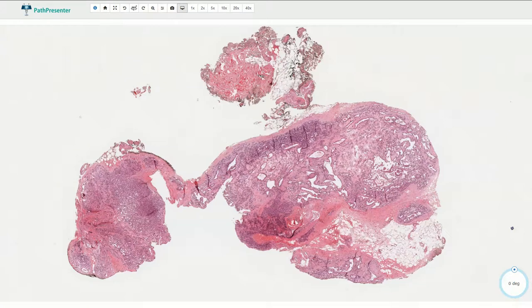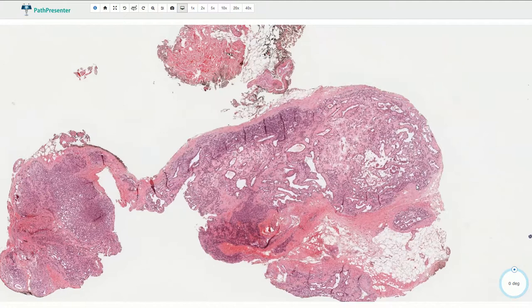Papillary endothelial hyperplasia, also called Mason tumor, is a benign reactive lesion characterized by papillary endothelial proliferation within the blood vessels. It is commonly localized in the deep dermis or in the subcutaneous tissue. It is a reactive vascular proliferation and is technically a manifestation of the organizing intravascular thrombus.